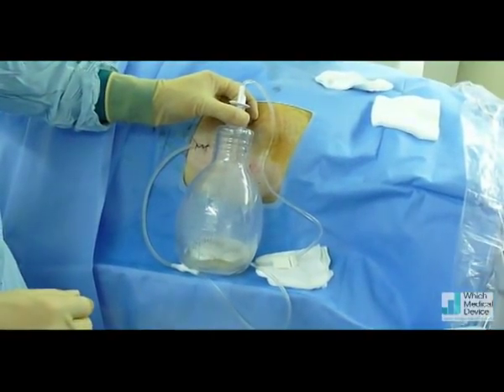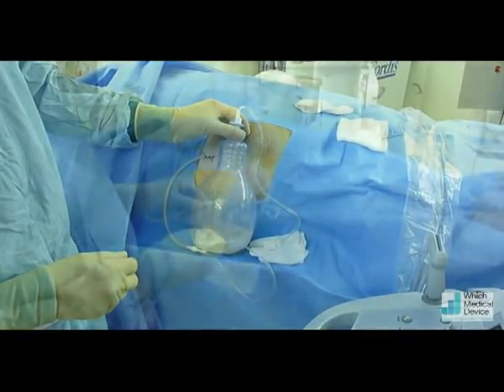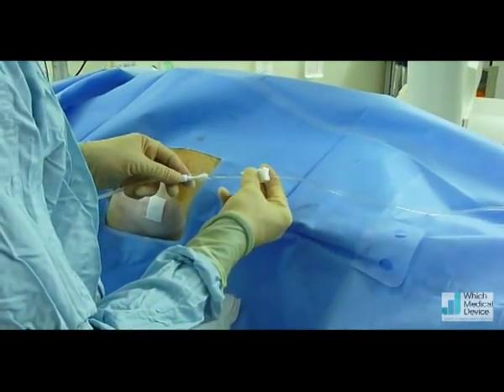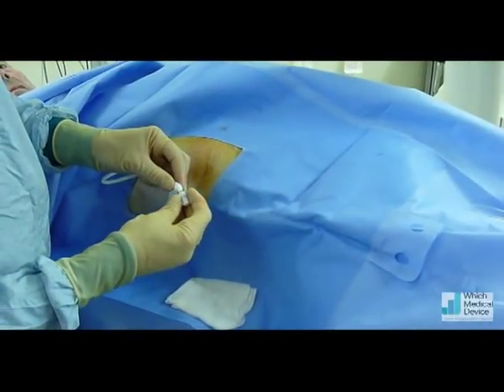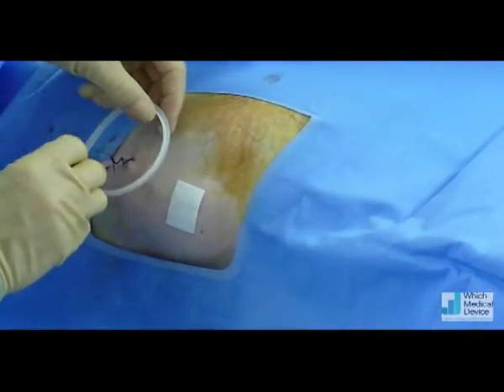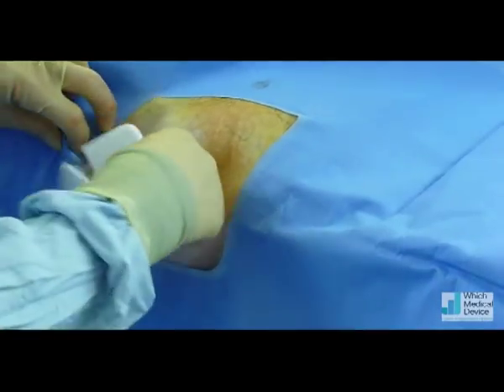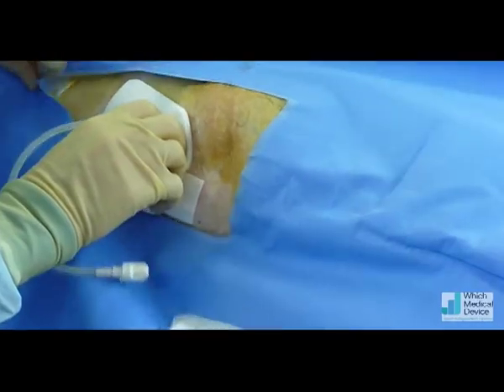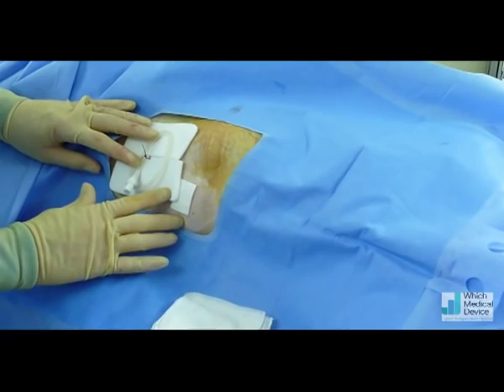This patient's had numerous drains in the past and we're not worried about fluid shift in this situation. We've drained a litre now, so we're just going to put the clamp on, disconnect, and then the kit comes with a cap which locks into place. We're going to coil this up onto a little dressing, then pop a dressing over that to keep it all secure.